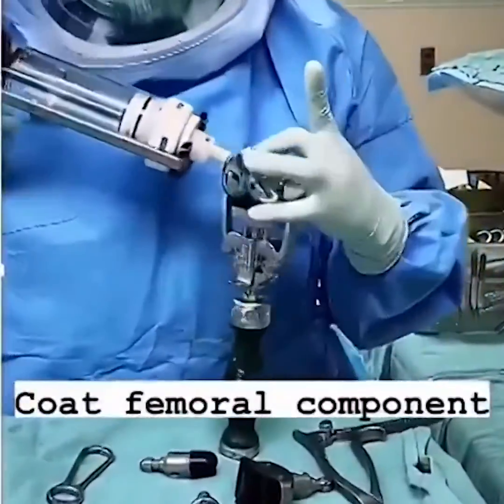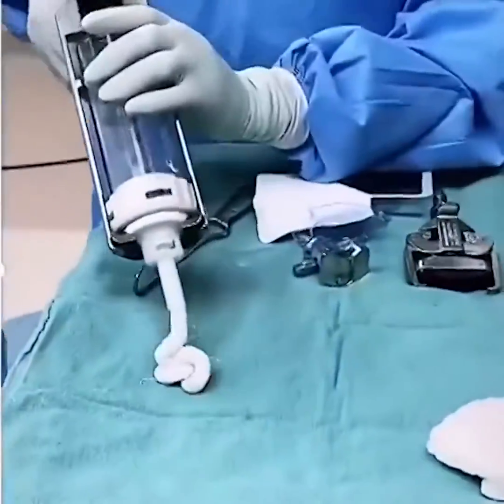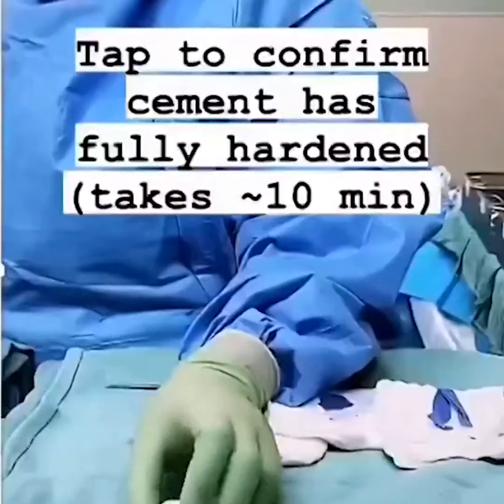So when we talk about replacement parts, either the hip or the knee, they can be press fit into place — so no cement — or you can use cement. There are advantages to both.